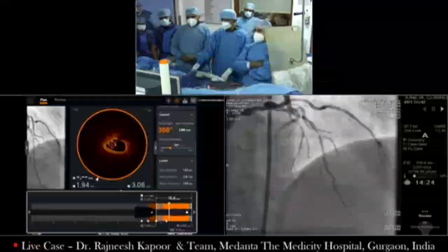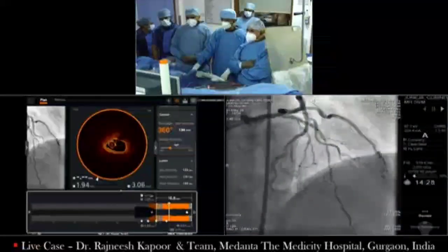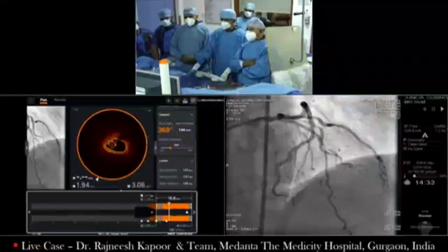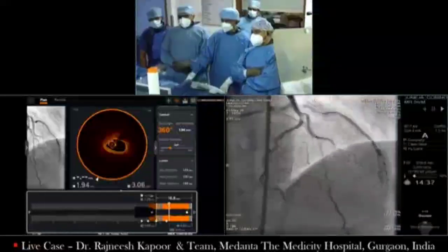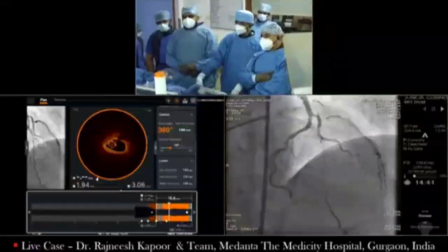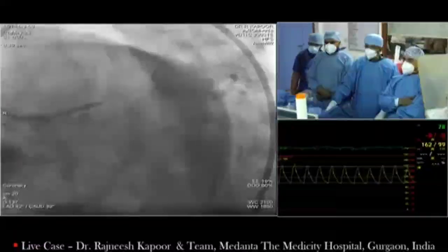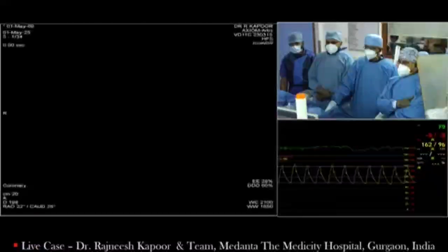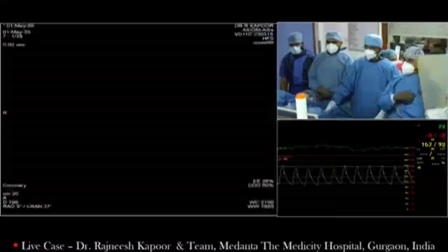I agree with that. Manish? Yeah, I totally agree with Goran here. This is a very heavily calcified mid-LAD. Orbital is a choice, and I'd love to see what they did with it, but my choice here would be front-cutting rotational atherectomy with a 1.5 burr. It's a very densely calcified LAD and we require some calcium modification. An atherectomy device is the choice, so I'll tell you what we did.